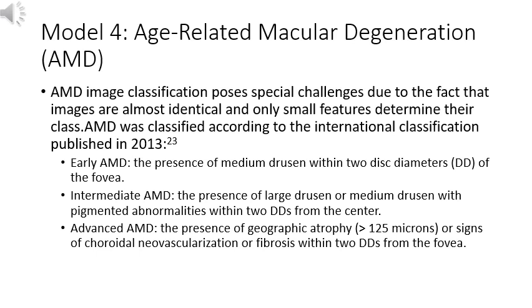We propose a novel architecture for AMD binary classification which will be referred to hereinafter as AMDNet. The architecture of AMDNet allows us to extract small details and features while also making predictions with relatively few trainable parameters, around 241,000, in comparison with other well-known architectures such as ResNet 50 or Inception V3 which have approximately 25 million trainable parameters. The AMDNet architecture is presented in Table 2. We trained AMDNet from scratch with the data specifications presented in Table 1.